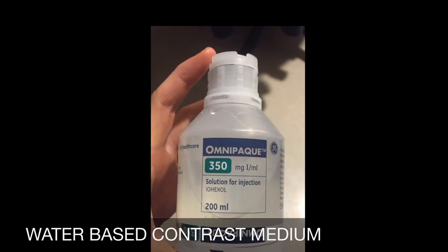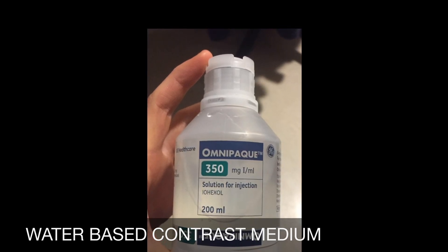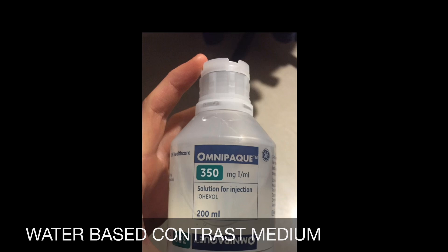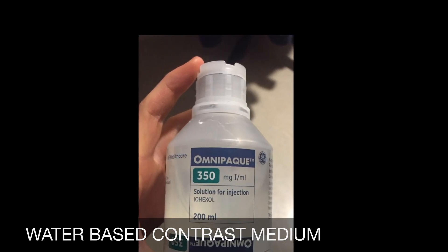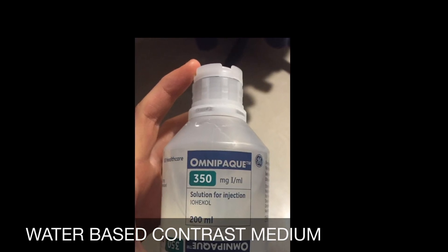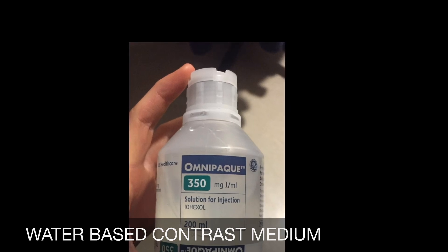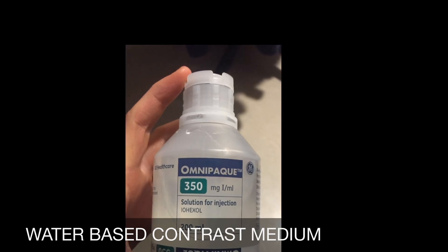The contrast medium we used was iohexol, which is a non-ionic aqueous solution. The advantage is that the patient doesn't feel any discomfort during the procedure. The disadvantage is that we get poor contrast images when compared with oil-based solutions. We then take a radiograph to assess the status of the ducts and the gland.